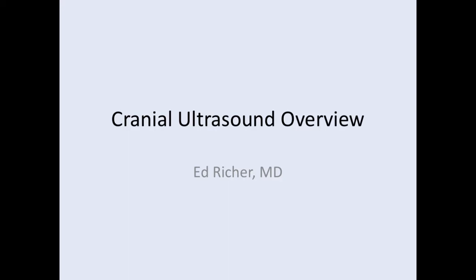Alright guys, this is the second video on cranial ultrasound. In this video we're going to be talking about cranial hemorrhages, germinal matrix hemorrhages, and other types of hemorrhages.